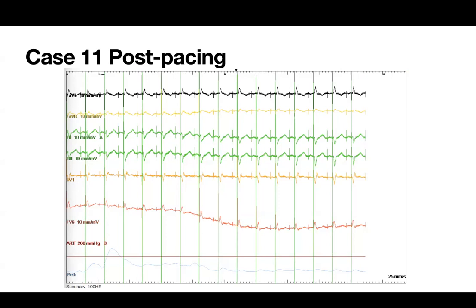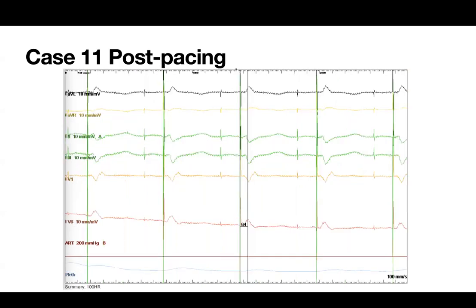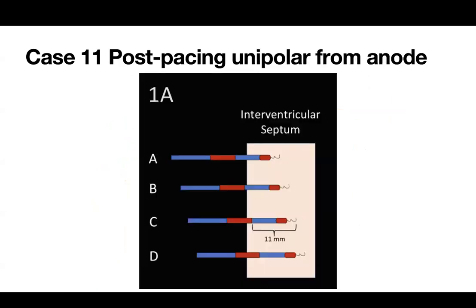Just as you're asking, this is the setup we have in the CatLab. It's the Sensis Vibe. I work with 6 leads: I put aVL on top, aVL and aVR next to each other, 2 and 3, V1, V6. I find that if I'm seeing all these leads live, that's all the stuff you need to look at. You can do all the measurements. You're on 25, you can go to 100. It's included in all the CatLab packages, so it's not a big deal. So this one, the LVAT 64 milliseconds, and go next.